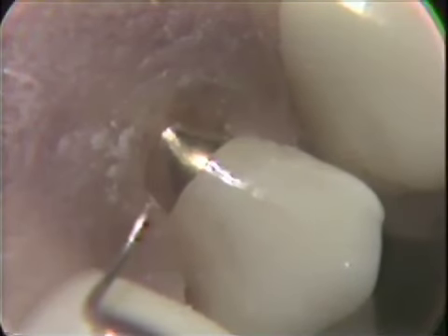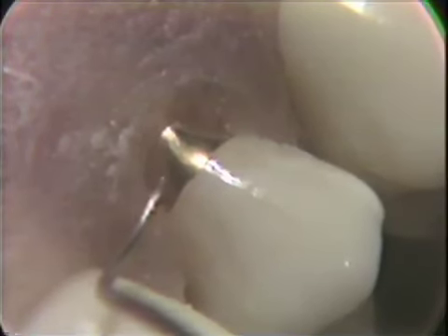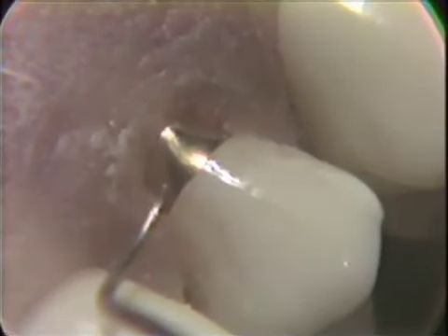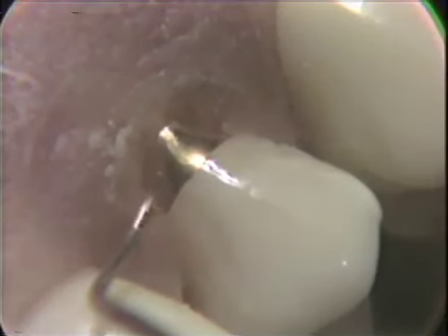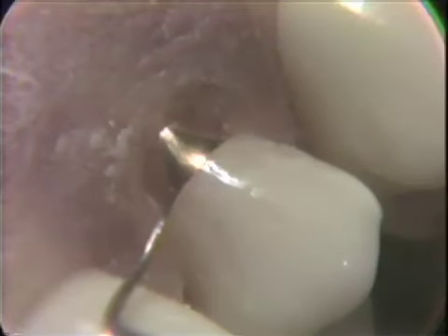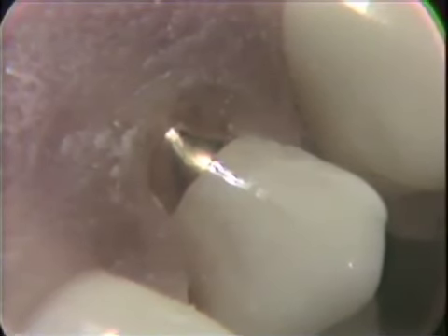The original high finish that we had placed with the tin oxide and the rubber cup has also been reduced slightly, going back now into this area that is visible, using the Silex again to put a slightly matte finish on this surface and have the restoration less conspicuous. So this then completes the Class 5 cohesive gold restoration utilizing the alloyed filling gold material.